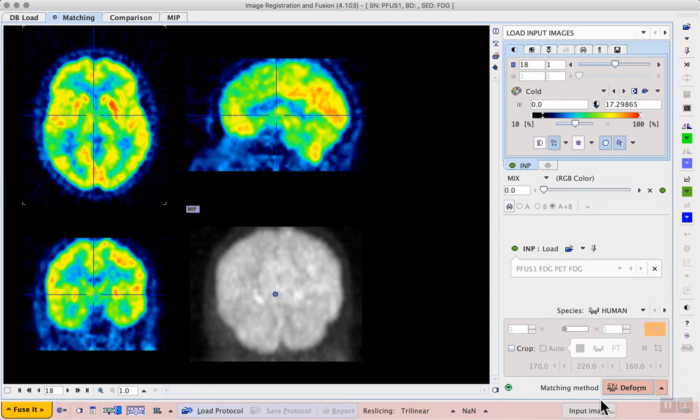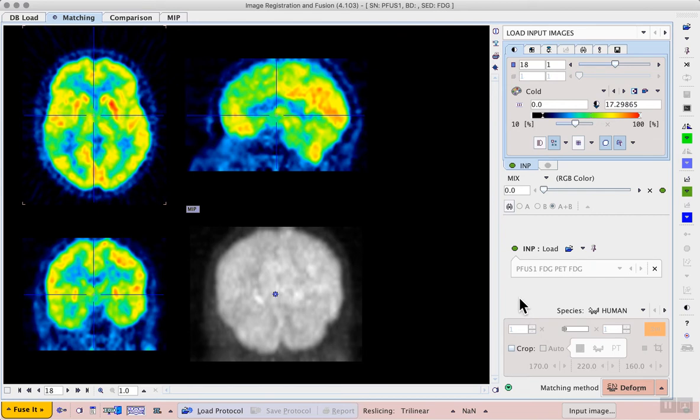Now in the lower right we see the setup for our workflow. The species has been correctly detected as human and we don't need any time frame averaging because we have a static PET or cropping since the image shows only the head particularly focused on the brain in this case.